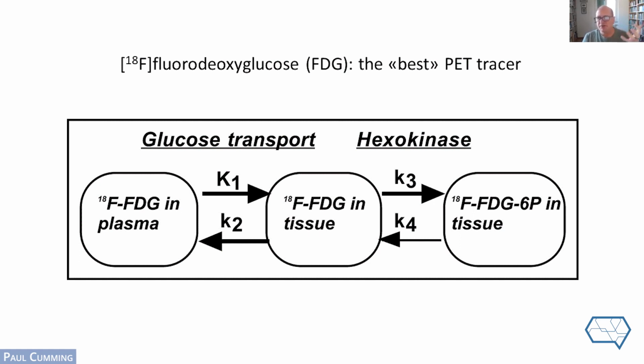And so that is the fundamental basis of the PET signal specifically with fluorodeoxyglucose or FDG, that it's trapping in a metabolically active tissue like brain, and there's no tissue so more metabolically active than brain. It gives you an index of how rapid the metabolic rate is in that tissue, and that can change from day to day, or it can change as you age, or very importantly, certain neurodegenerative diseases will compromise the normal metabolic rate in brain. Next slide.